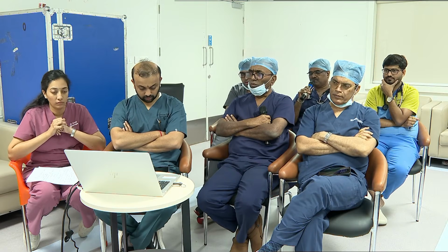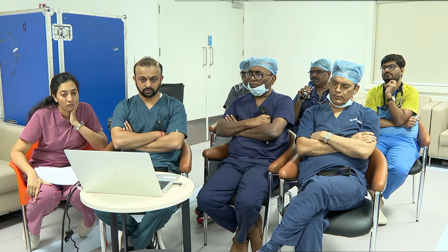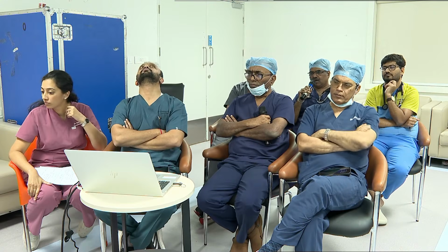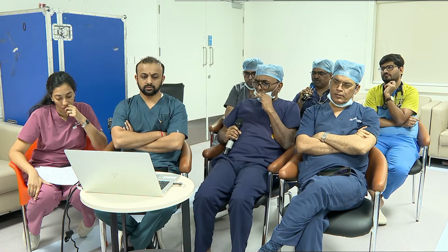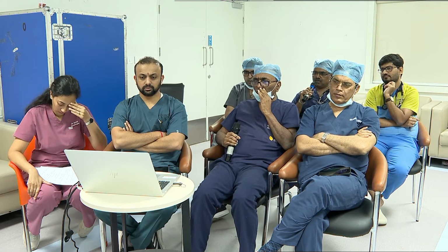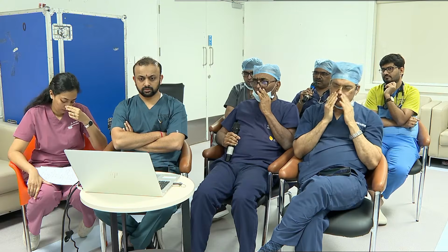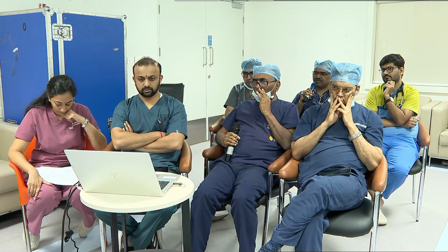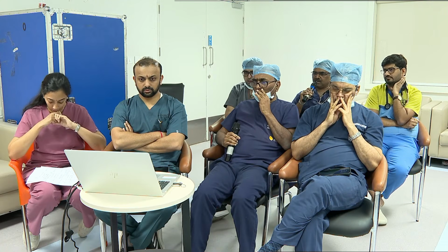What are the sites of calcification, particularly? Suppose how is the membranous septum and all those things. If there is any severe calcification at the leaflets or at the membranous septum, there is all the more possibility of complete heart block. And sometimes if it is opposite to that, then it may cause some ruptures or paravalvular leaks. All these complications may take place. So the importance of the access, the extreme tortuosity, and then the calcification of the wall, the common femoral anterior wall, and all those things.